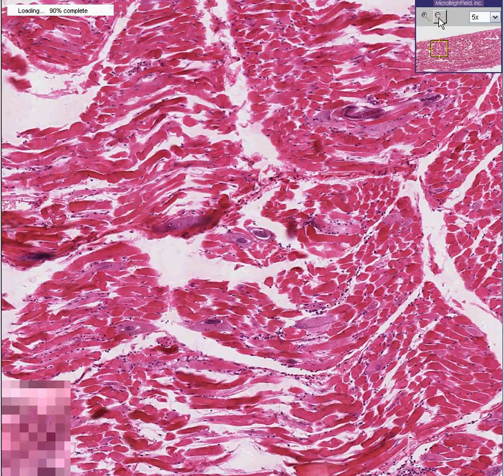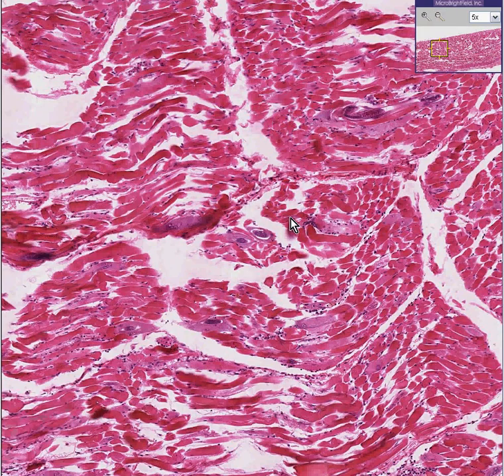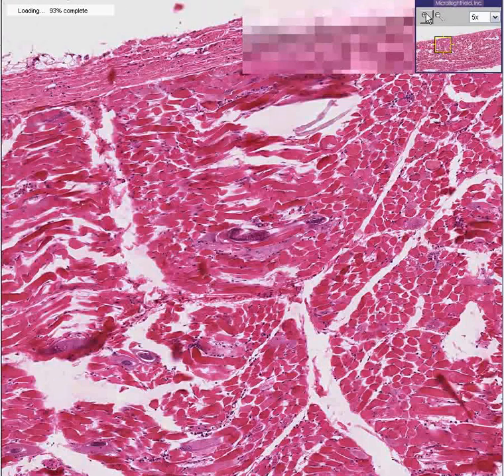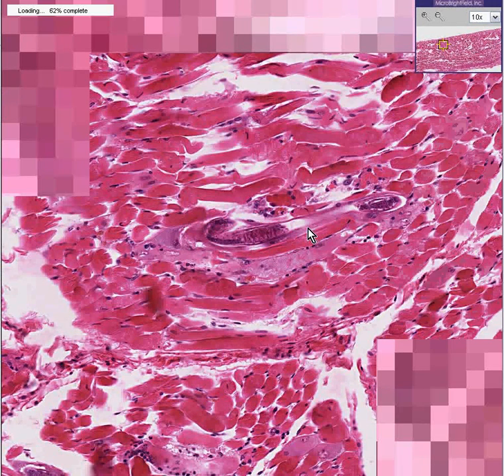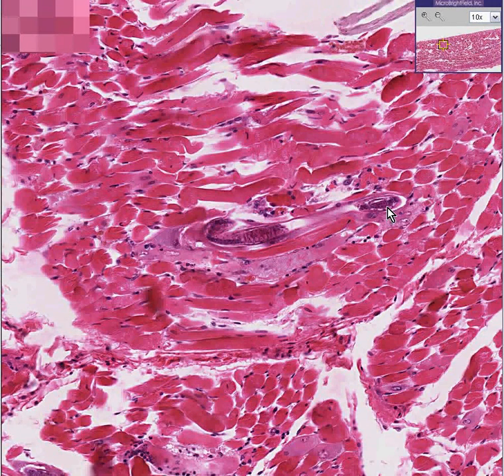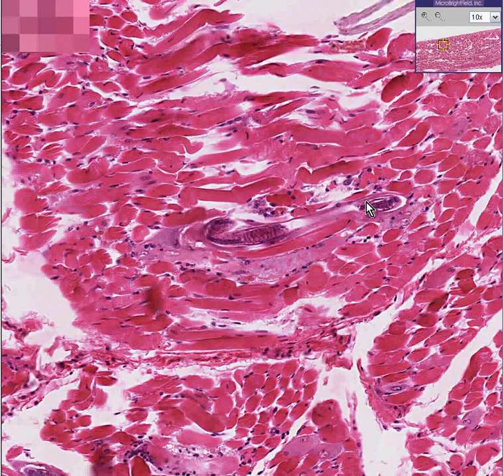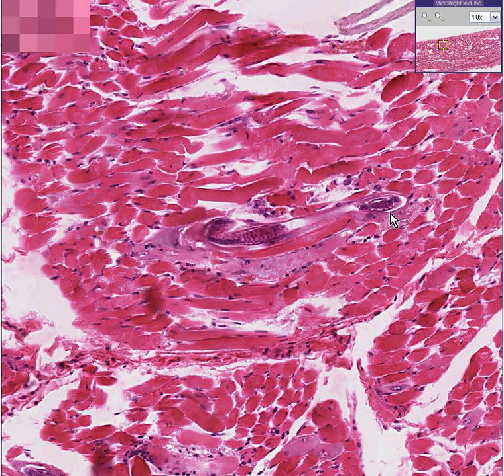Like in the other case, some are bigger than normal — here's one that's a little bit bigger than usual. You can see once again this is not human tissue at all. These are the larval cysts of Trichinella, implanted very nicely, smoothly, and subtly without any or much inflammatory reaction into a histologically normal striated voluntary skeletal muscle.